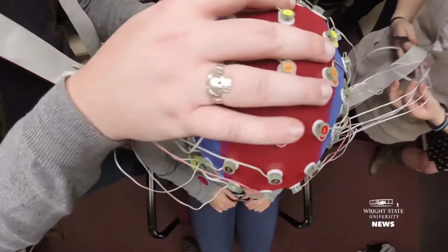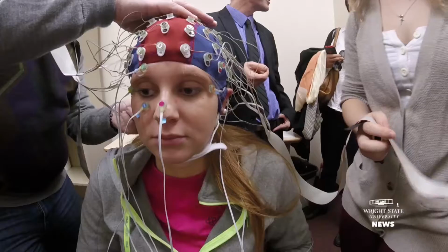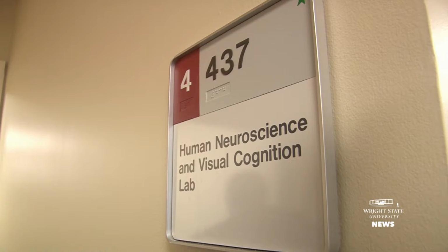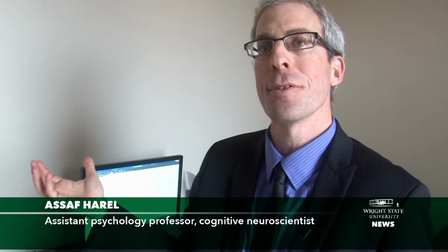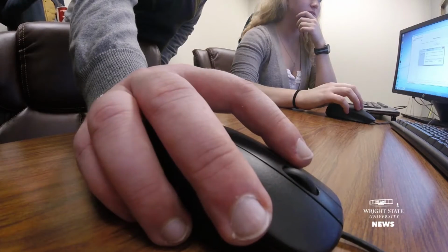So you don't see with your eyes, right? We're not cameras. We're actually cognitive agents, and we're actually seeing with our brains. So this is a kind of classical cognitive neuroscience lab. We're going to measure ERPs, which are event-related potentials, which is a form of EEG, to understand how we understand the world, and visually, cognitively, how those different processes are implemented in the brain. And this lab is basically built to facilitate this whole data collection and data analysis process.